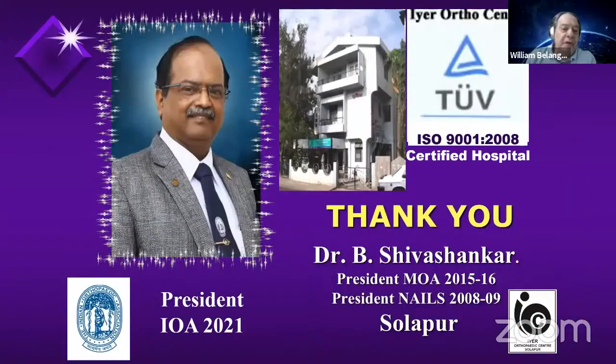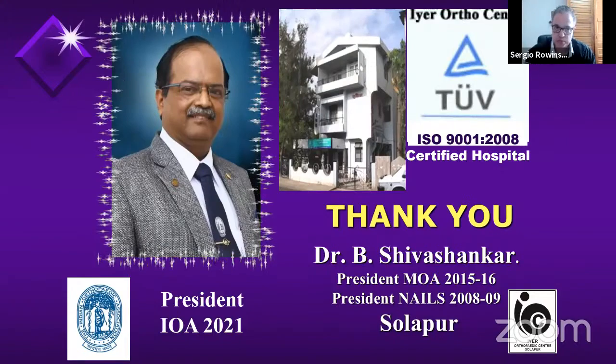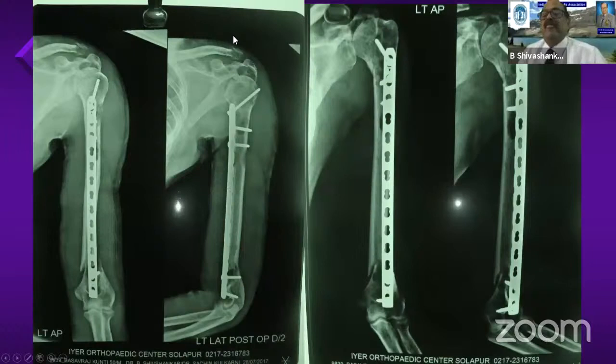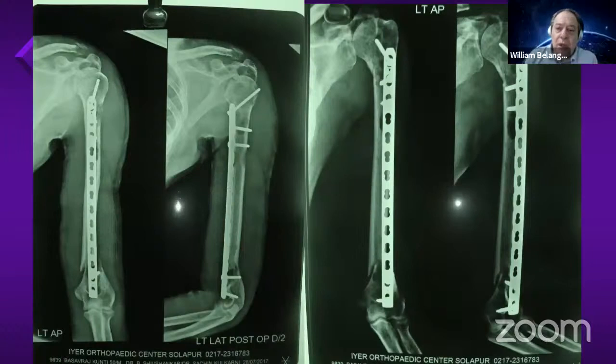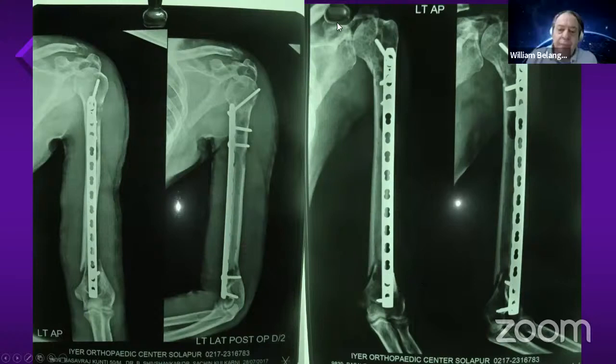Now, Dr. Shiva, one question. Belangero, you can speak. For this last case, would a nail be a good option or not? I thought nail is also a good option, but this distal fracture was not healed. You can see this also had to be stabilized.